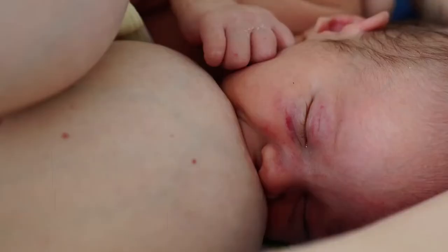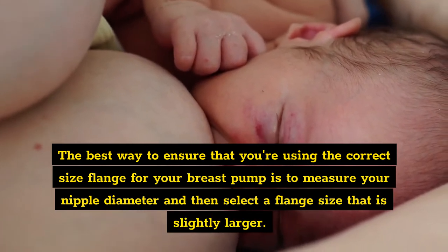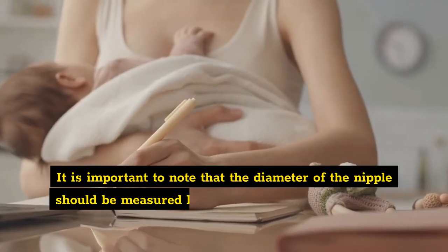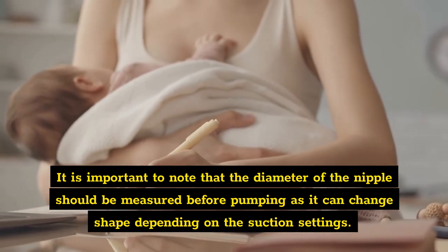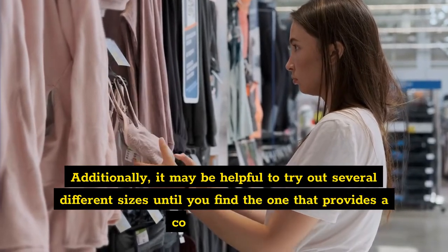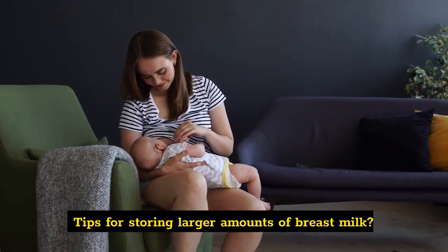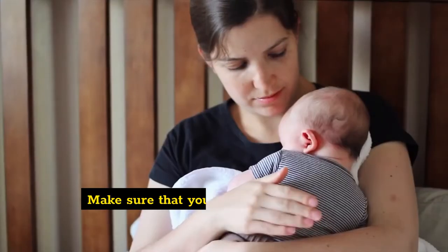How can I ensure I'm using the correct size flange for my breast pump? The best way to ensure that you're using the correct size flange is to measure your nipple diameter and then select a flange size that is slightly larger. It is important to note that the diameter of the nipple should be measured before pumping, as it can change shape depending on the suction settings. Additionally, it may be helpful to try out several different sizes until you find the one that provides a comfortable fit.